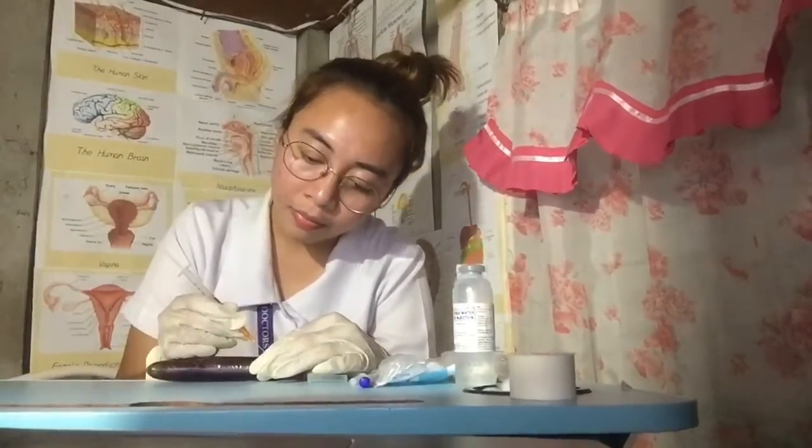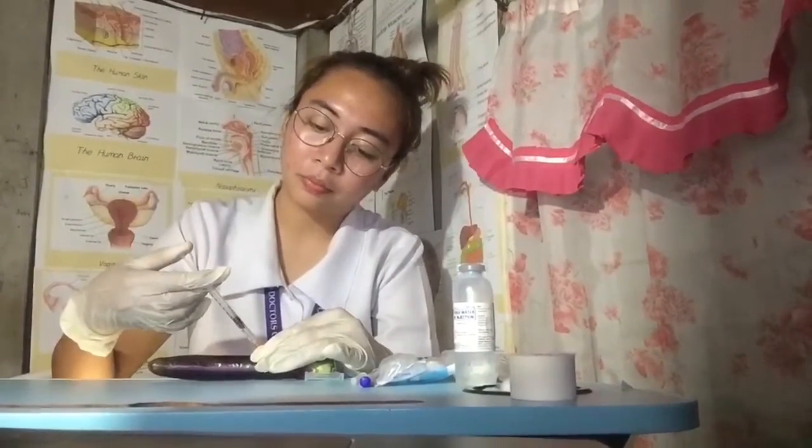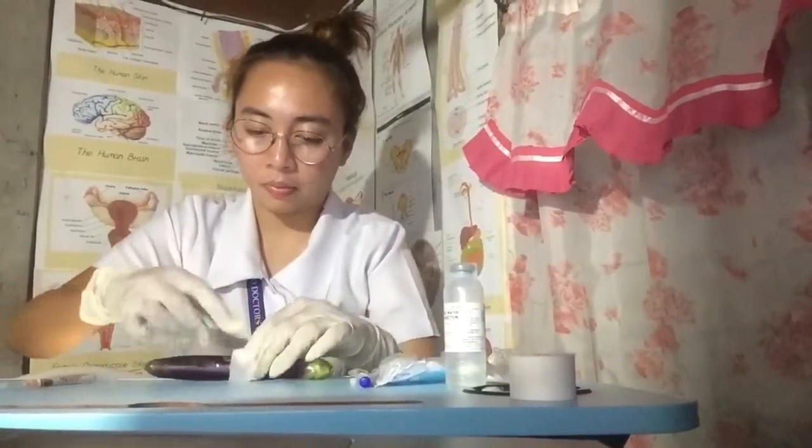So now let's go into the injection site, and now activate the needle safety and discard the uncapped needle with the attached syringe in the receptacle.